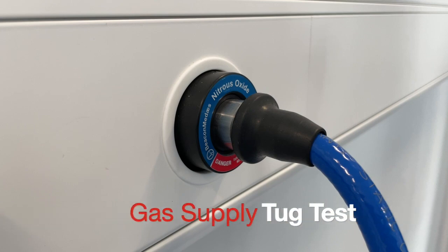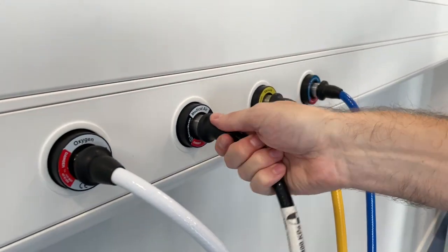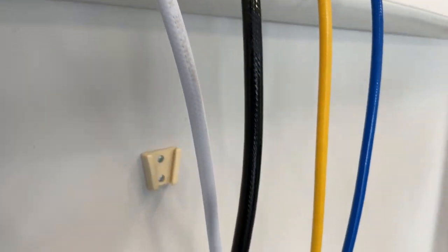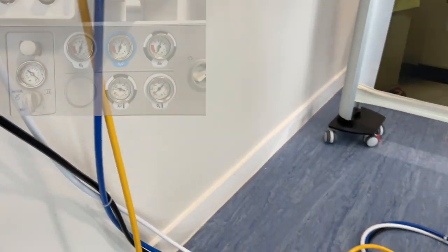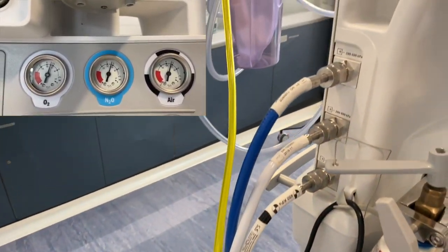Next we look at the gas supply and we'll start with the pipelines. Gently pull on the pipelines to ensure that they are securely connected. Ensure that there is at least four bar of pressure within the pipelines by reviewing the Bourdon gauges on the front of the machine.